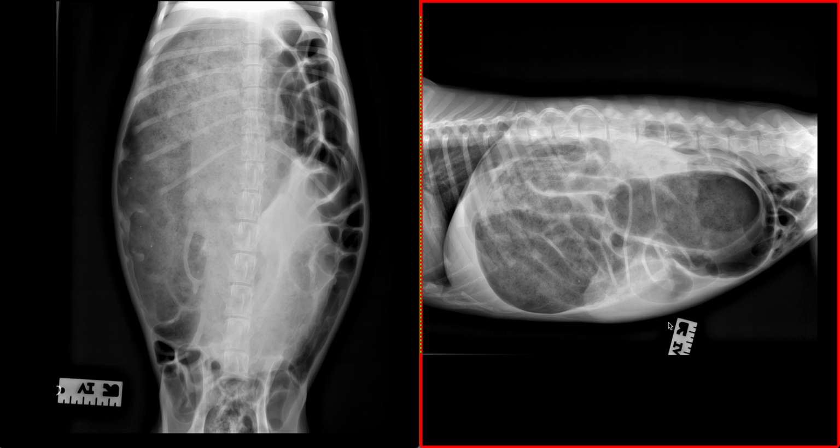There is markedly dilated segment of the gastrointestinal tract that is potentially contiguous with the gastric fundus or could represent a portion of the colon. If it represents a portion of the colon, we have to consider the potential for colonic torsion. If it's contiguous with the gastric silhouette, this further supports the differential of gastric malpositioning.